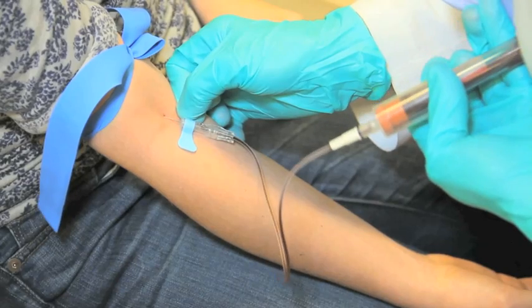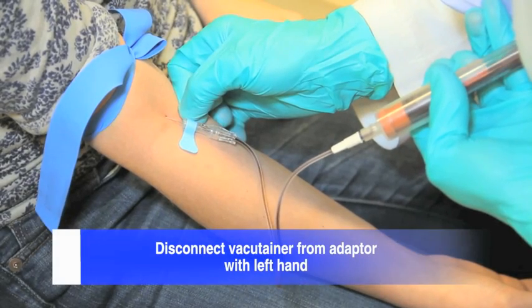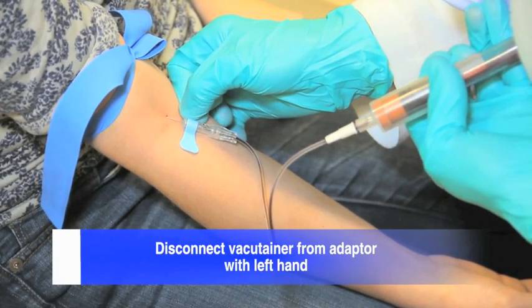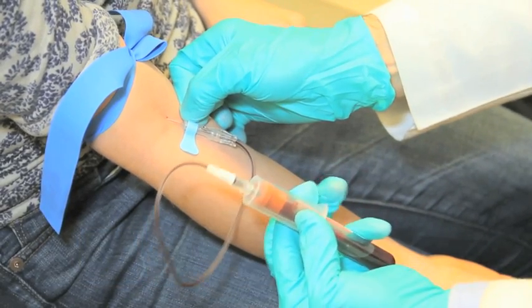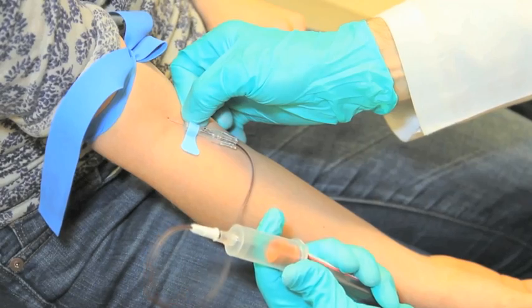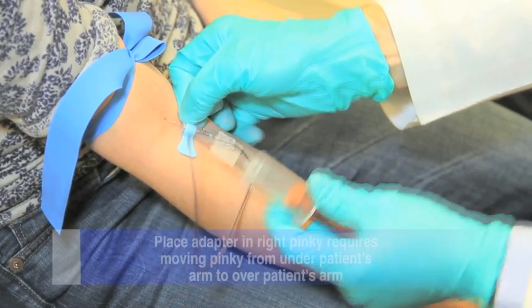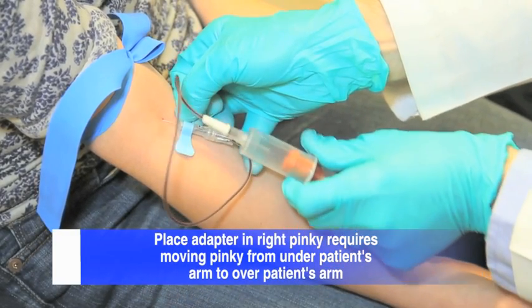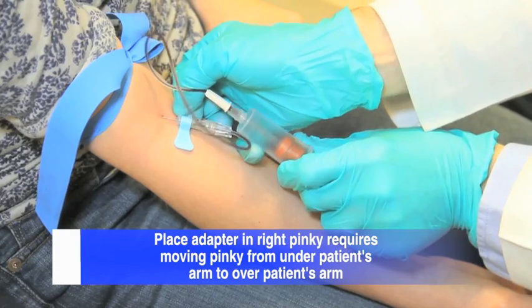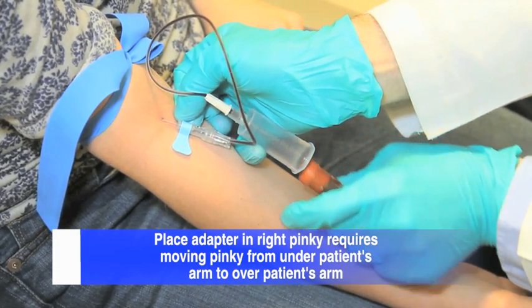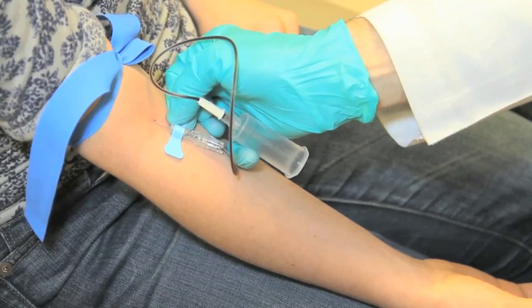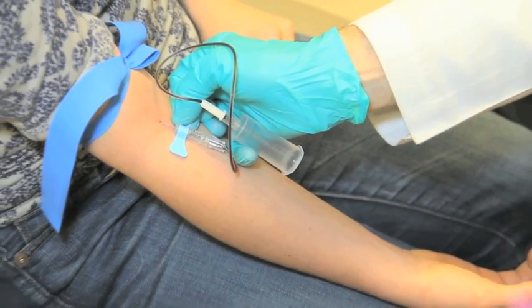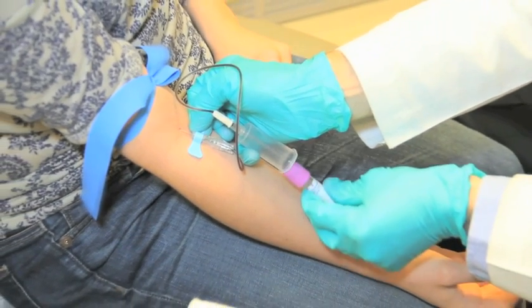To change tubes, first release the vacutainer from the adapter. To do this, grasp the vacutainer in your left pinky and the adapter in your left thumb and index finger. Upon abduction, you will successfully release the tube from the adapter. Next, place the adapter barrel in your right pinky. Note that during this maneuver, the right pinky will move from underneath the patient's arm to over it. You are now able to gently remove the vacutainer from the adapter with the left hand, place it on the tray, and grab the next tube.